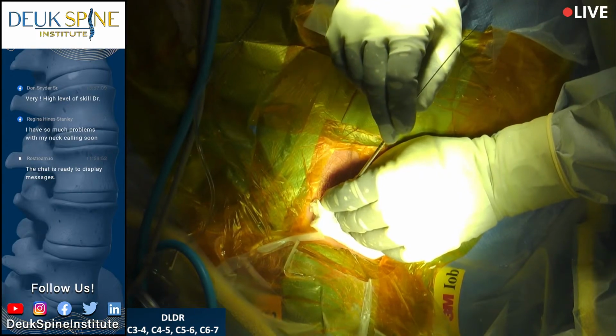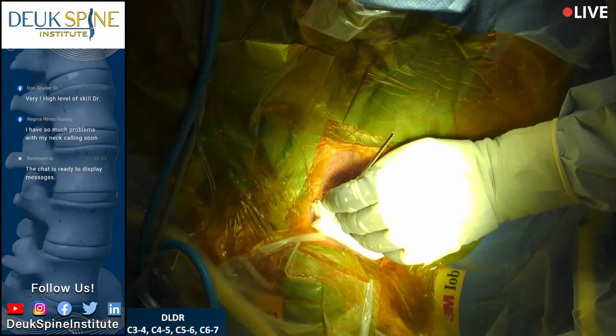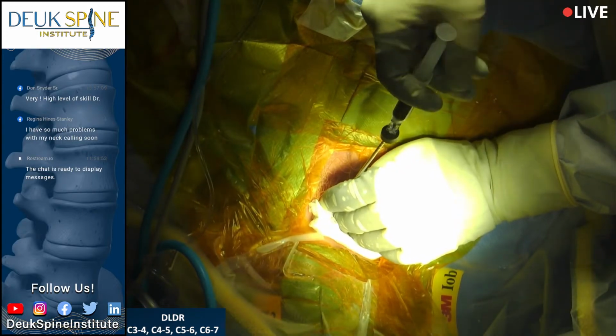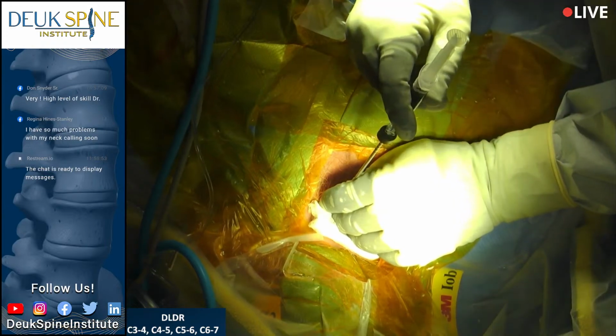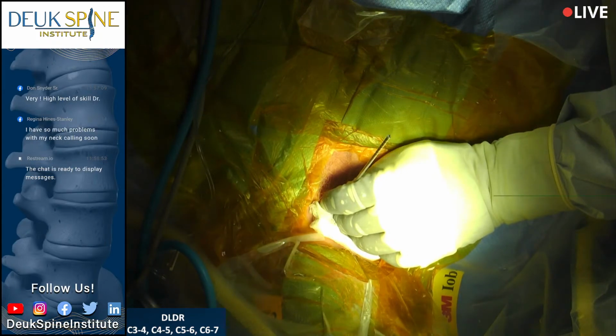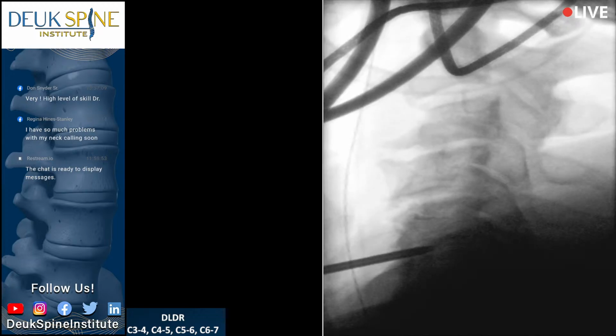All right, lateral. That's good. Let's get a discogram juice. We're going to do our discogram at 5, 6. Let's see if anyone can figure it out. Shot? Oh yeah, that was good. You can see the dye came out. Let's get a good pull. All right, let's get a good pull. Here, I'll do it. I'll do this and shot. We should be able to get a good shot. Let's clean that up down there.